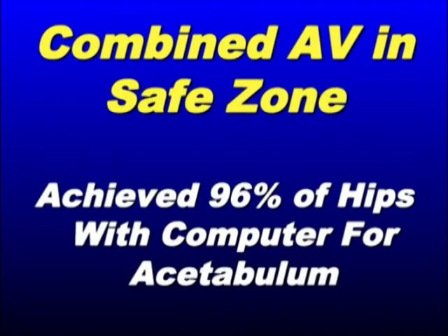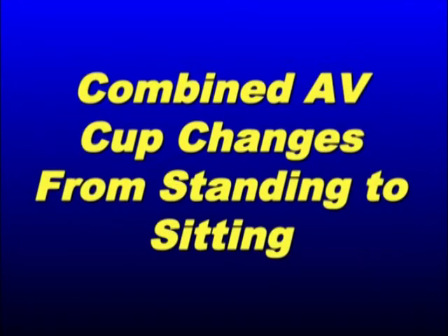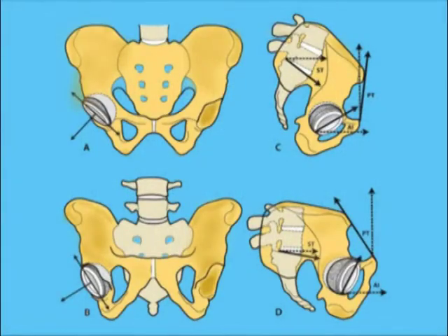And as you can see from our data here, once we get good at estimating the femur and we have numbers for the acetabulum, which we have with computer navigation or with robotic use, I was able to get a correct combined anteversion in 96% of my hips, which means that I've got really good mating of the femur and the cup. Now, the reason that good mating of the femur and the cup is really important is because the cup does change as we go from a standing to a sitting position. And this is data we've really kind of begun to learn about mostly in the last 10 years. I'd say that Lazennec was the one that really brought that to everybody's attention, and we've worked on that also.